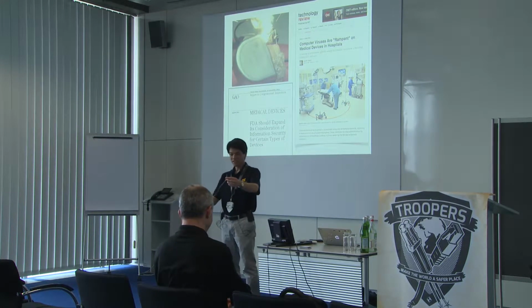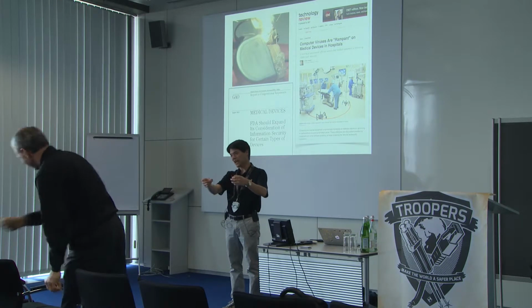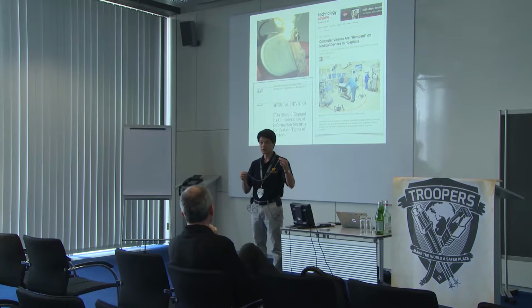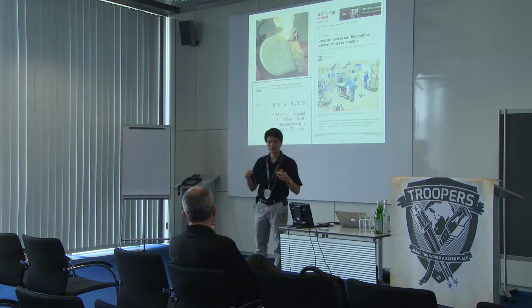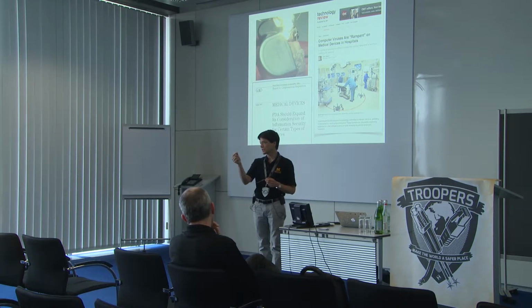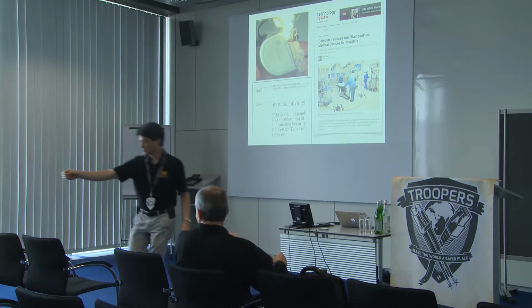And then this is an electrode. Actually, what happened is he got a replacement, so he got a new device. And this is an example of the electrodes that are woven through a sacrificed blood vessel. A vein, usually; it depends on the country. In Germany, I believe they do it a little bit different than in the US, but this is woven through a blood vessel, and then the tip, you can see it looks like a grappling hook. There's a bunch of different styles, but this one's more like a grappling hook. This actually is inside the chamber of the heart, doing both sensing as well as sending shocks, whether it be pacing shocks, which are tiny shocks, or defibrillation shocks, which are much larger. You can pass this around too. Just please make sure it comes back.